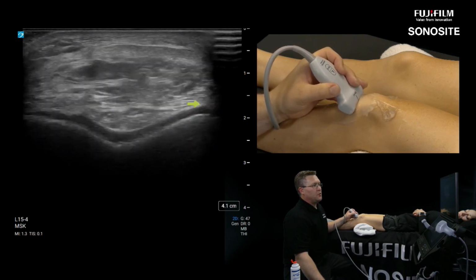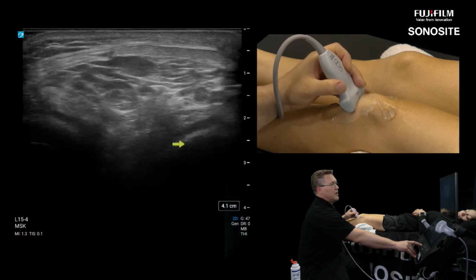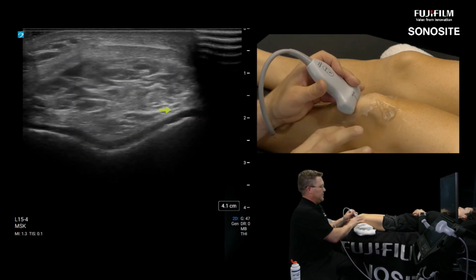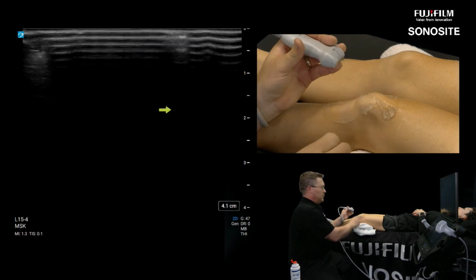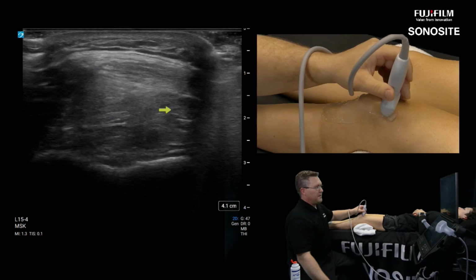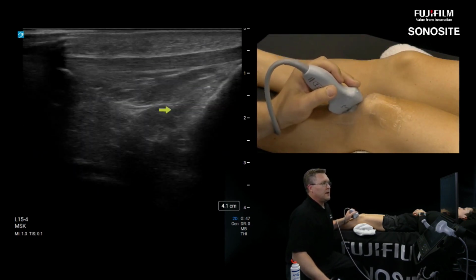We're on the anterior, more inferior part of the trochlea here, and in the distal, deep part of the image, you can see it divide into the 2 condyles of the knee. That gives you an idea of just how deep we are seeing. I don't see the big anatomy illustration of a big bag of fluid that you see hanging on the doctor's office wall for the knee. I always see this huge bag of fluid that they're injecting or aspirating, and it's always infrapatellar, and I can say I've never seen that with ultrasound. I always see that big bag of fluid up here in the suprapatellar recess. But that's about all I can go on and on about the infrapatellar and suprapatellar anatomy.